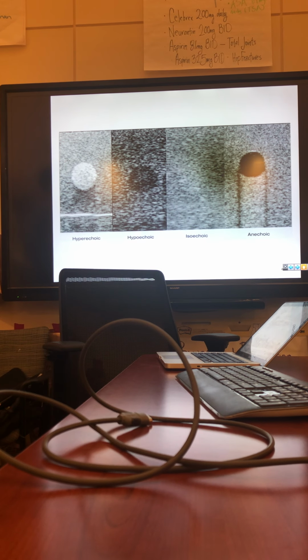There wouldn't be an ultrasound lecture without physics. This is all of the physics of ultrasound summed up in one thing that we really care about, so I'm not going to bore you with the details. But just some of the terminology, when I start going through things, I'm going to use it.